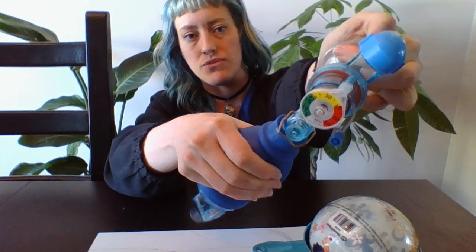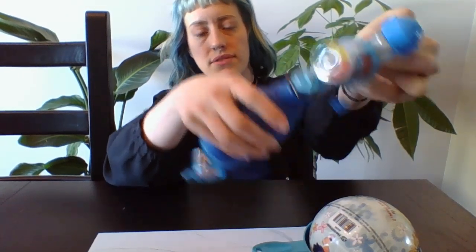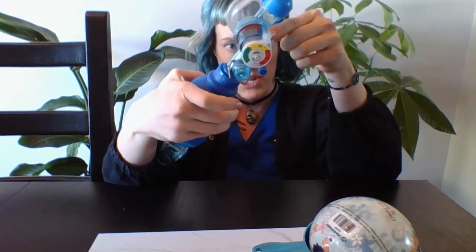And you should make sure that you have a good seal. Before ever doing this, you want to make sure that when it's properly sealed, you're seeing that it's inflating well, and you've got your pop-off there at 40 centimeters. So you're going to position the mask that way.